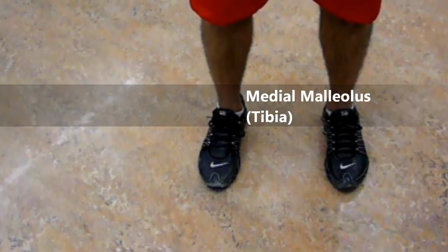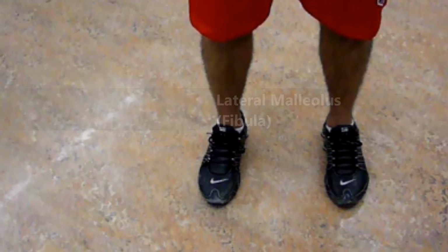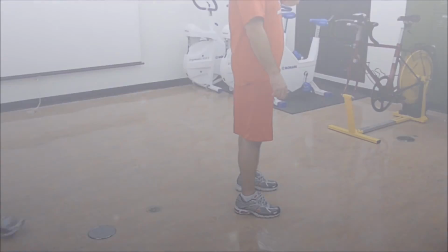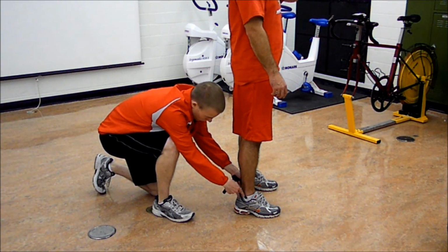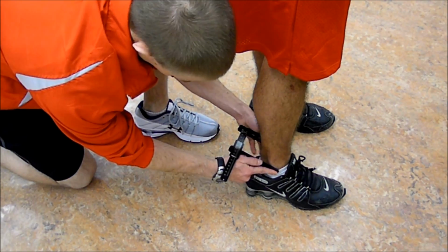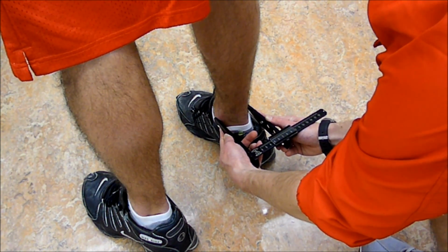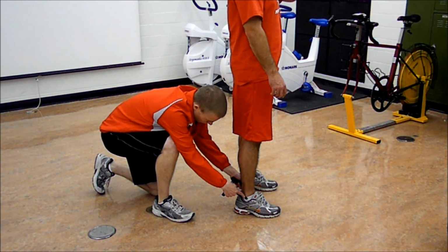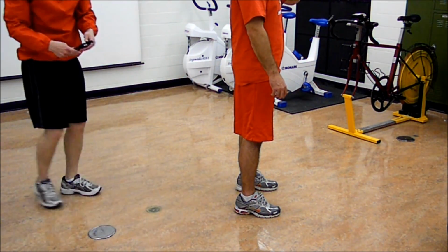The anatomical reference points for the ankle skeletal diameter measurement are the malleoli of the tibia and fibula. The participant should be standing upright with the weight evenly distributed between the feet. This measurement should be taken from a position behind the participant. The tips of the caliper should be applied at an oblique angle on the most lateral aspect of the lateral malleolus and the most medial aspect of the medial malleolus.